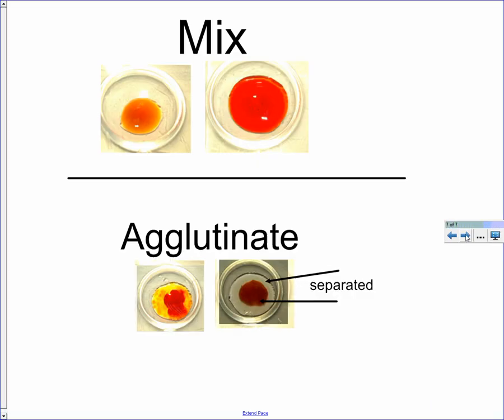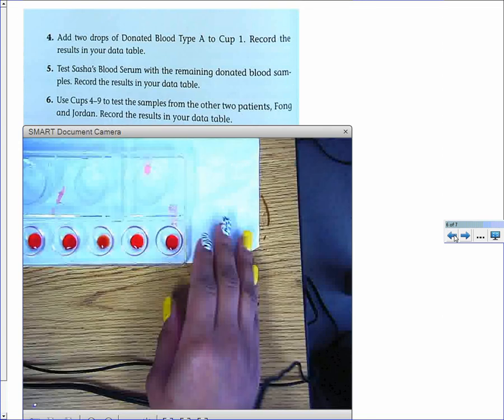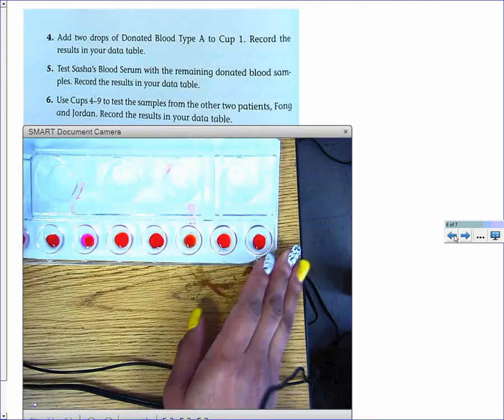Again, here is a picture of what it looks like mixed and agglutinated. And here is a picture of the entire results.